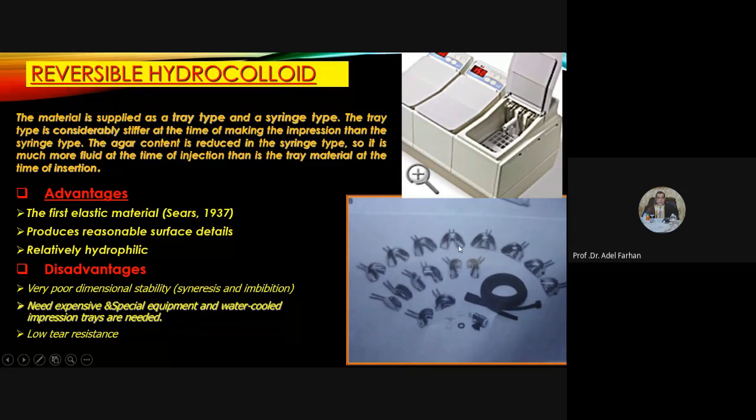So واحدة من disadvantage هو more expensive equipment is needed.